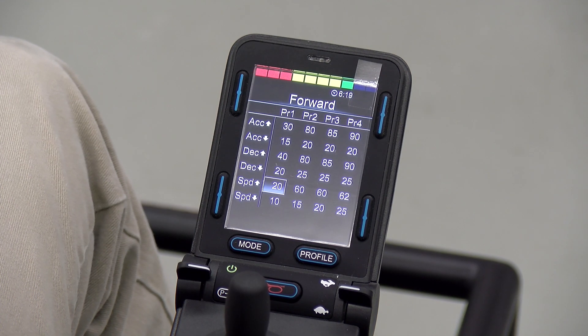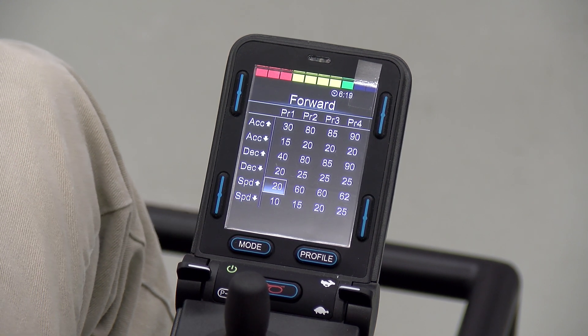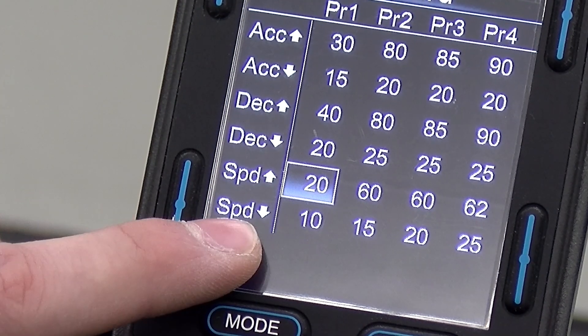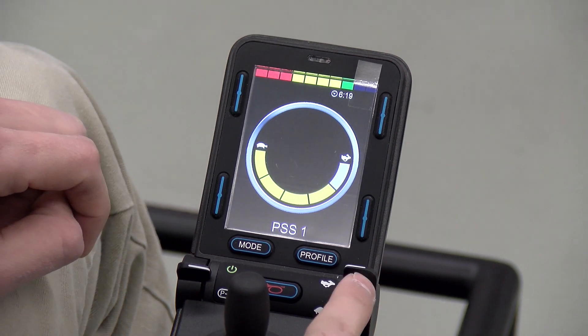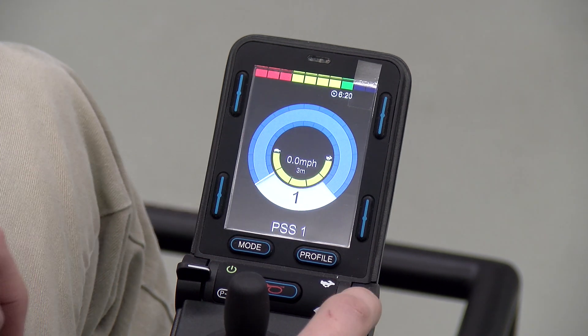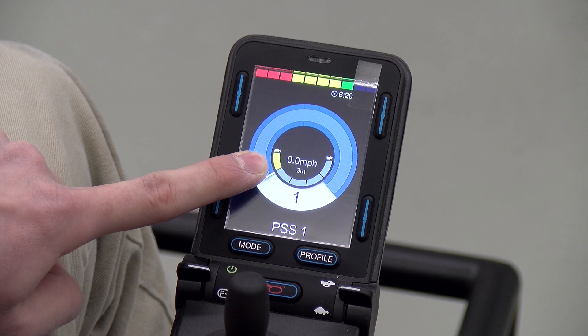The second thing I wanted to talk about is maximums and minimums. The setting with an up arrow is the maximum and the setting with a down arrow is the minimum. So for profile 1 the maximum speed is 20 and the minimum is 10. Directing your attention to these little yellow bars — with them turned all the way down this would be the minimum setting, so the speed would be set at 10. If we turn them all the way up, that's the maximum at 20, and anything in between will automatically adjust between those two. So if we set it in the middle it would be set at 15.